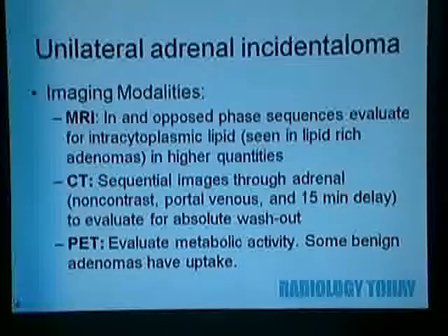Furthermore, we can use an adrenal protocol CT. Now that involves a pre-contrast image as well as portal venous and 15-minute delayed images. And this evaluates for two different characteristics of adenomas. First of all, the non-contrast images can look for a very low-density adrenal mass. If it's less than 10 Hounsfield units, it's got intracytoplasmic fat, it's considered a benign adenoma. And our workup would stop. That would be checked by a radiologist and would be done.